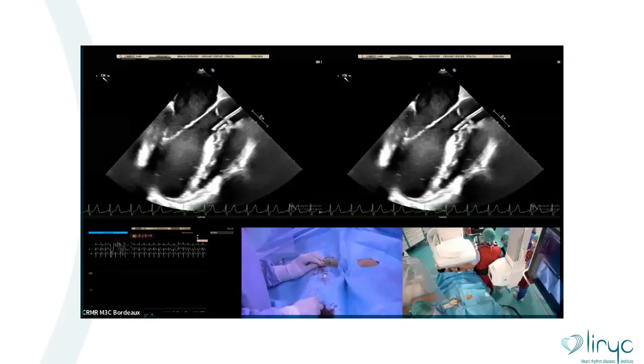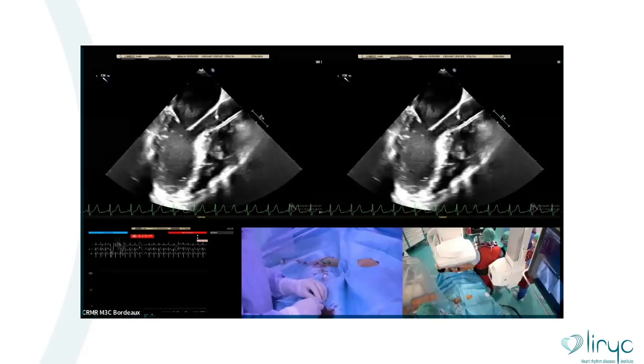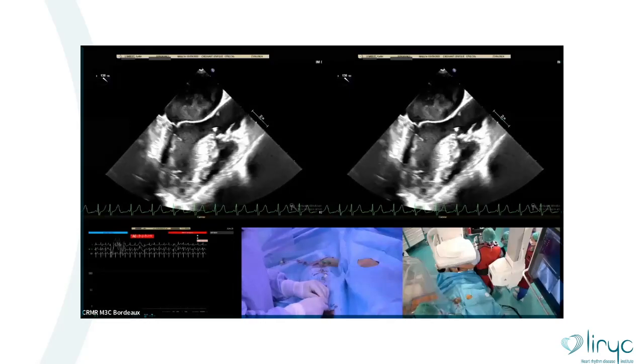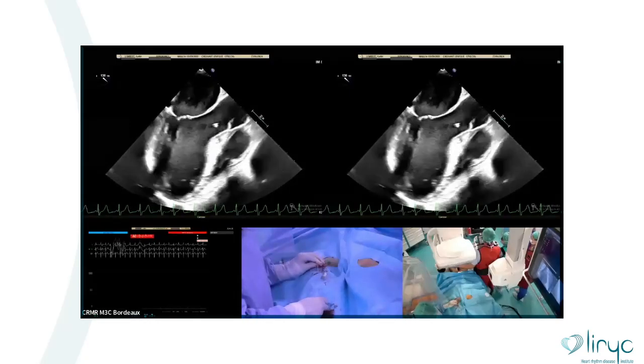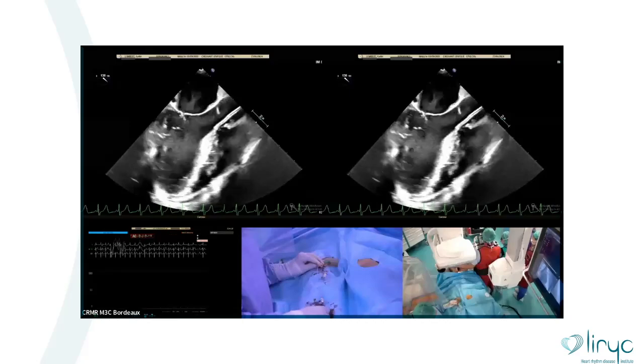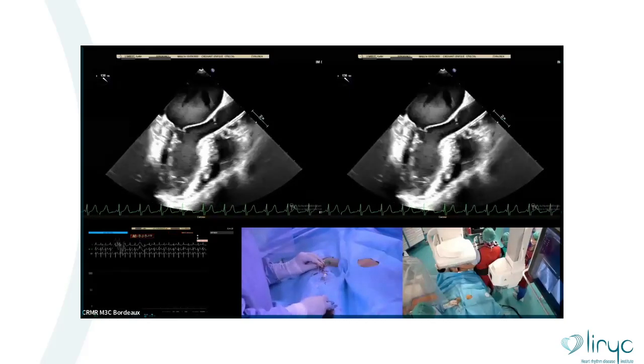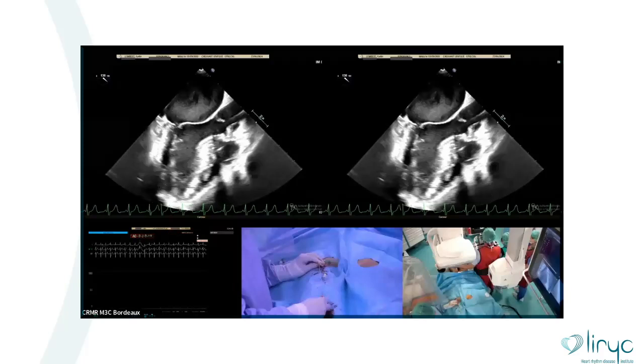Okay. So you are back in the LVOT. Correct me guys, but I think for you guys, the tip is pretty clear. So we pull back the wire? There is no wire. Just here, advance the wire. Use the wire to help you enhance the echo view.